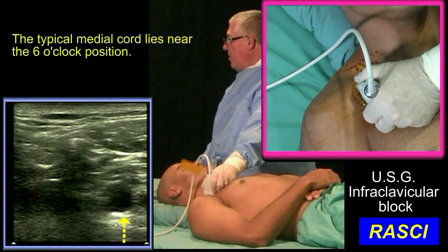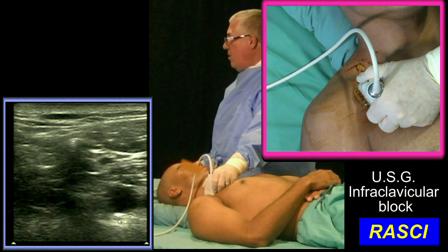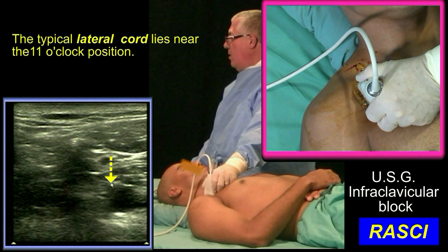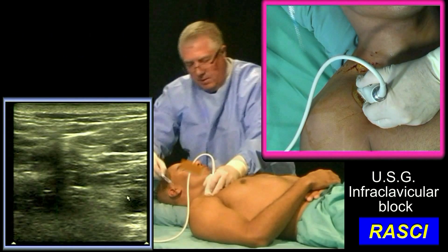I expect to find the medial cord here at 6 o'clock. If I don't get a twitch, I inject drug regardless. And then the last injection is up here at 11 o'clock, where I'll be looking for a twitch corresponding with the lateral cord.